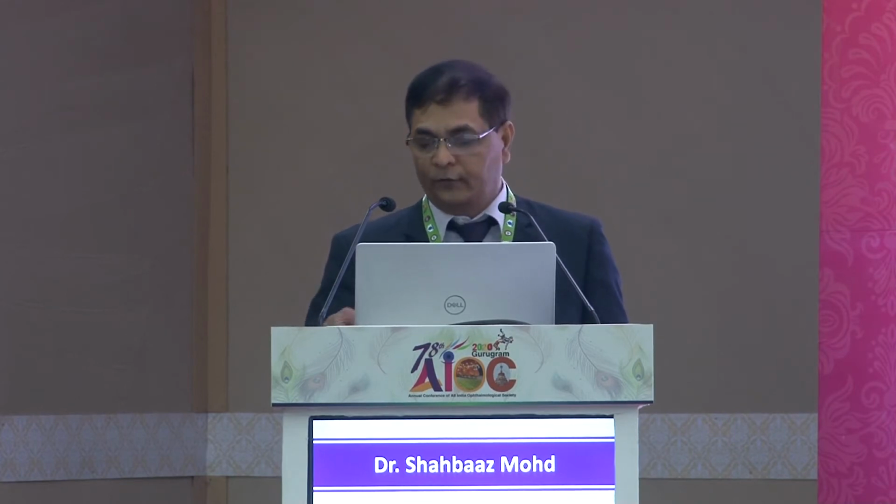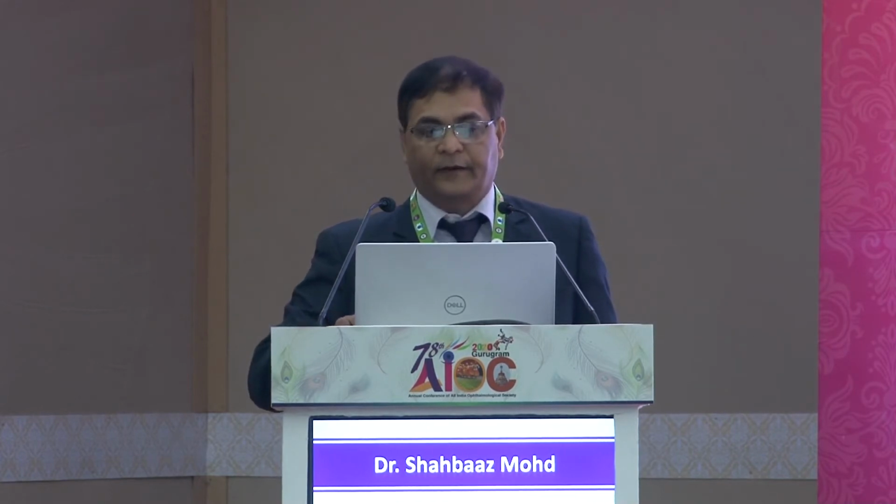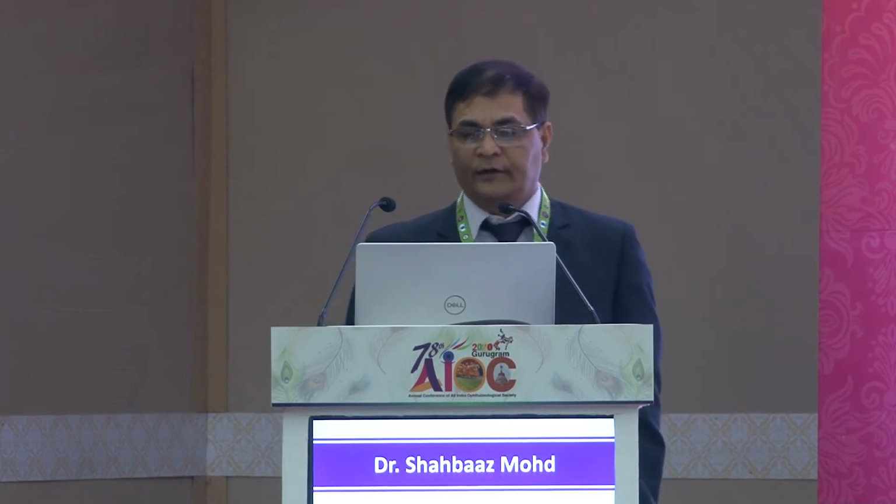You will get a vertical spike which is the anterior capsule, then the posterior capsule, then retina and sclera, and then the dying spikes of orbital fat. This is a small video demonstration of how to do it. A few things are important in this.